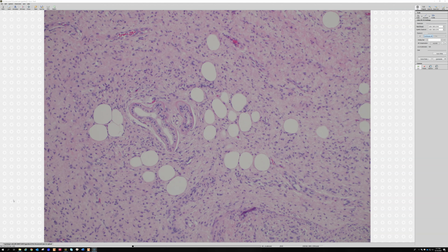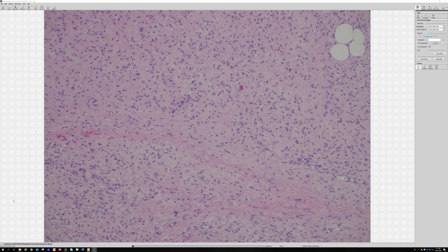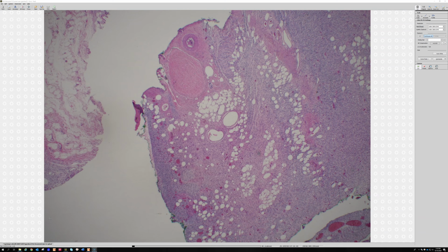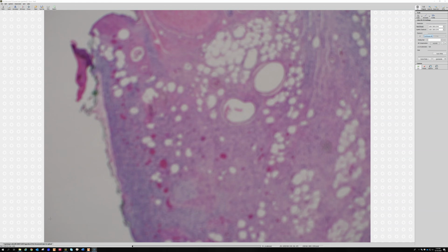And there's one thing that I wanted to show you, but this particular diffuse neurofibroma doesn't have. But there is a structure that is usually present, but not always, in diffuse neurofibroma. So I'm going to cheat and pull a different case here because this case has a very good example of this structure.